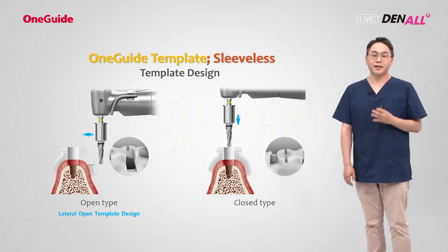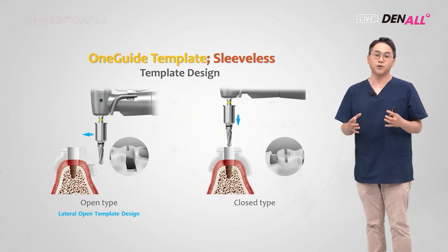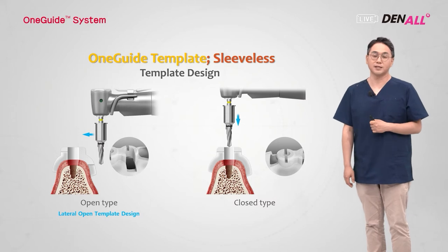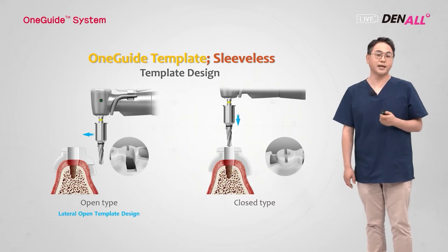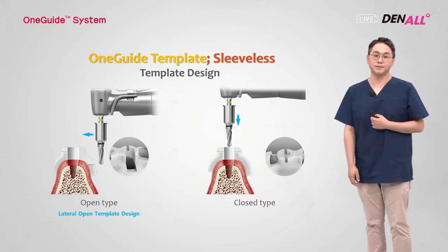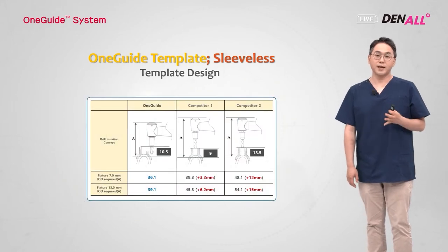OSTEM's OneGuide template is sleeveless. There are two types. Closed type means the guide hole is completely closed, so vertical access is possible. When a patient has an opening problem and vertical access is difficult, you could use the open type. You need to select which one to use.